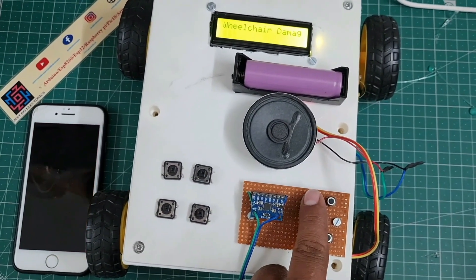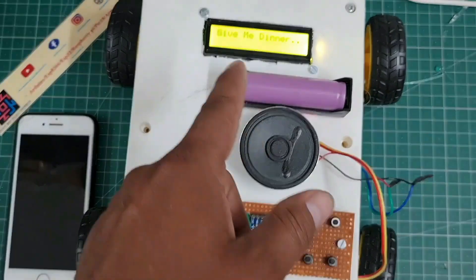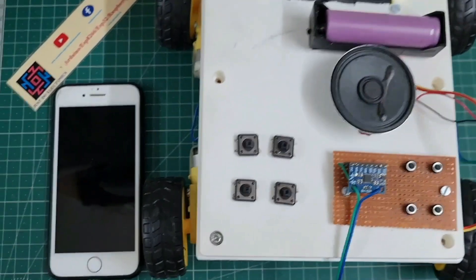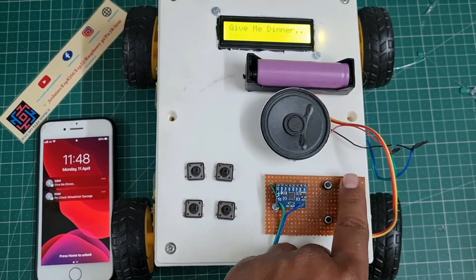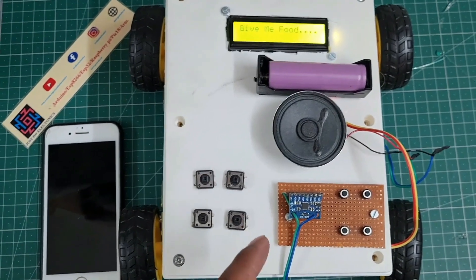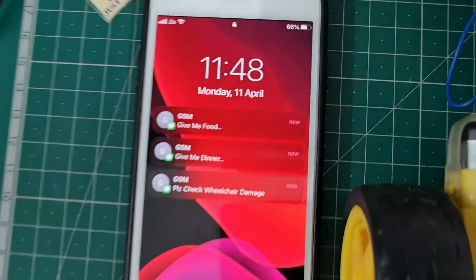When I press the first command button, the speaker will say 'Can you please give me dinner?' and the GSM sends that message to the particular mobile number. If you want, you can change this in the code. When I press the second command button, the speaker says 'Please give me food' and the GSM sends the text message 'Give me food.' Dinner and food are similar — you can change the commands to your own.